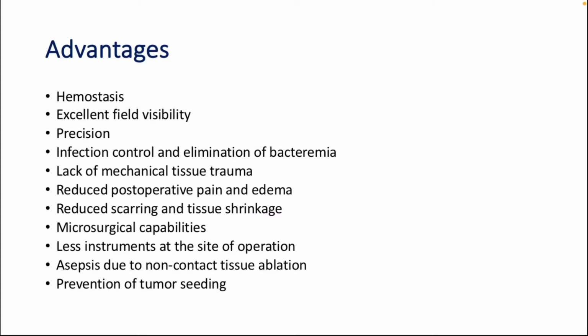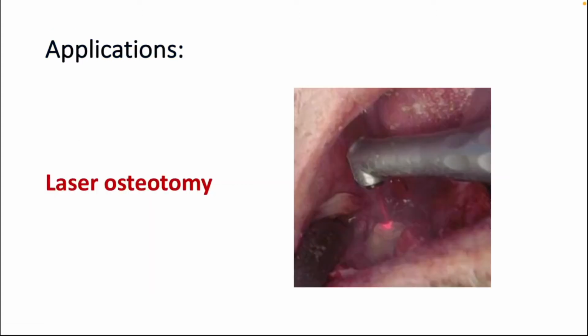Also, it reduces post-operative pain and edema, lack of scarring and tissue shrinkage, microsurgical capabilities, and a lot of advantages over the other surgical procedures in oral maxillofacial surgery.